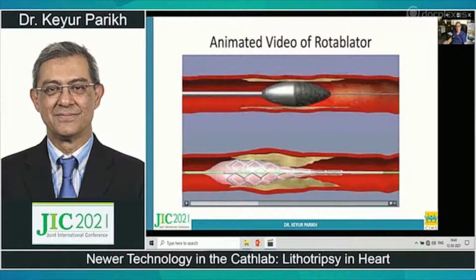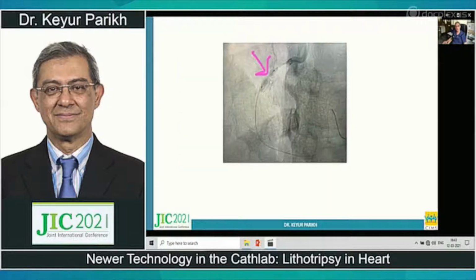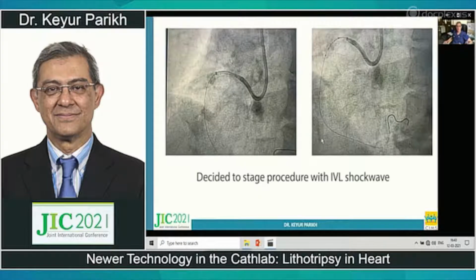In this case, we were unable to expand the lesion again, and the balloon, as you see here, did not open at the center. Because of the excess contrast which was given on that day, we postponed the procedure, brought him back after a few days, and decided to use IVL technology.